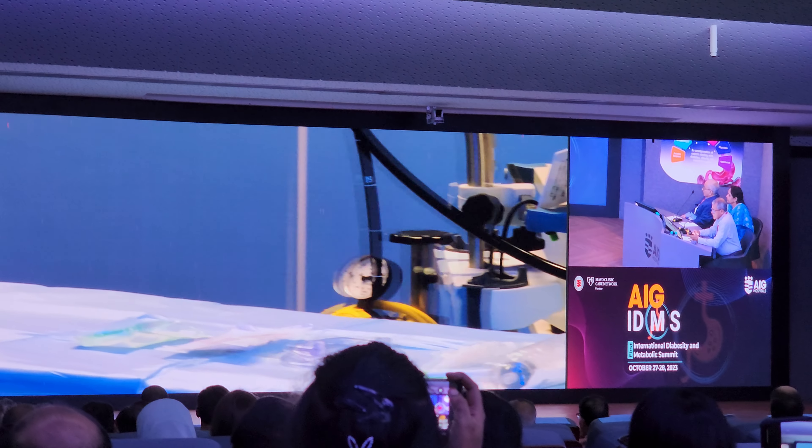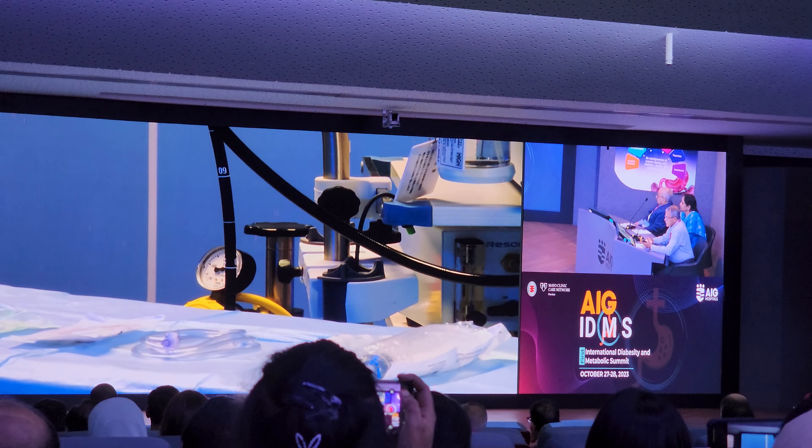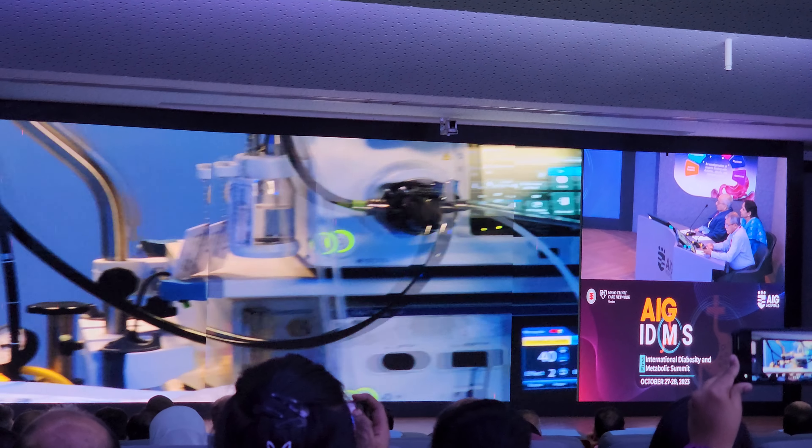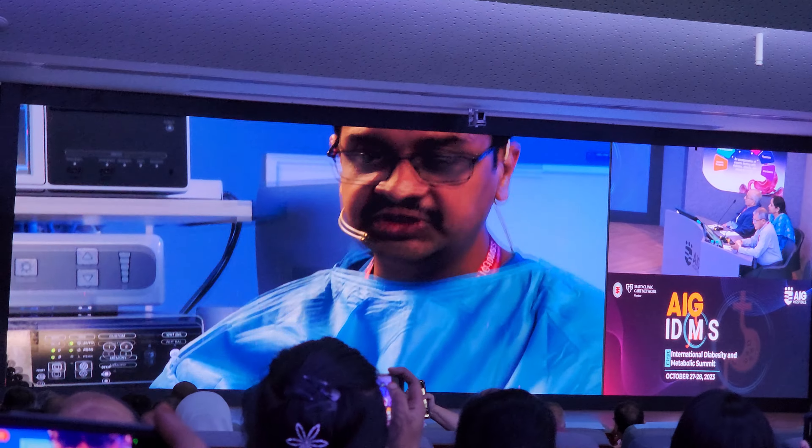We will show you how to apply this balloon on an endoscope and then deploy the balloon inside this patient who requires weight reduction for morbid obesity and diabetes.